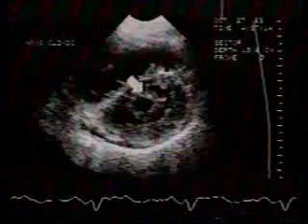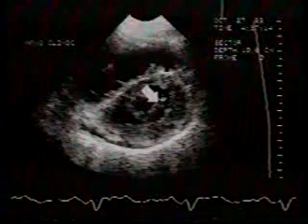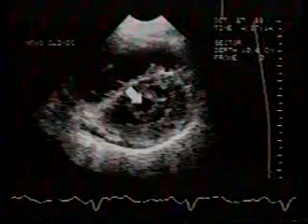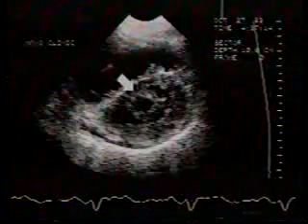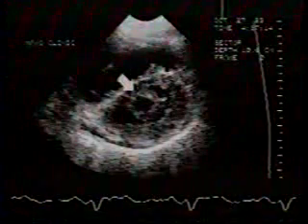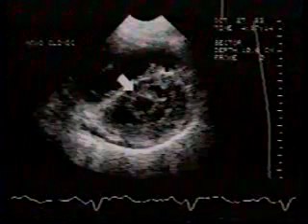Note the thickened mitral leaflets. Fusion of the anterolateral and posteromedial commissures has resulted in a severely restrictive orifice, which measured 0.8 square centimeters. In real time, the image will move slightly back and forth with respiration. Focus on the characteristic fish mouth appearance of the stenotic mitral valve.